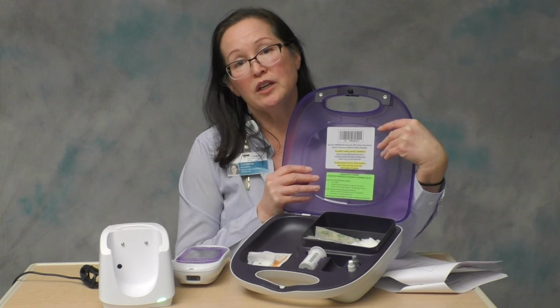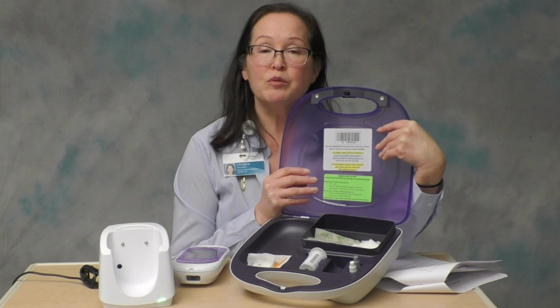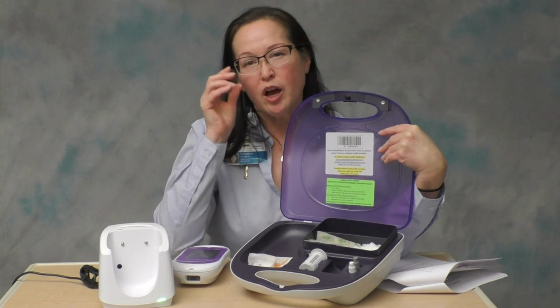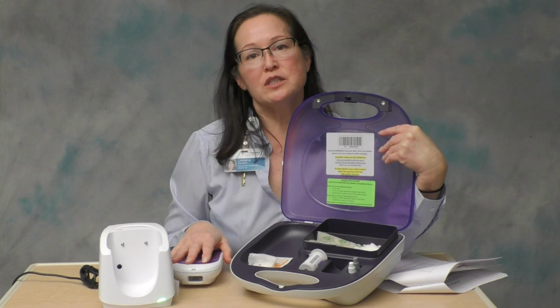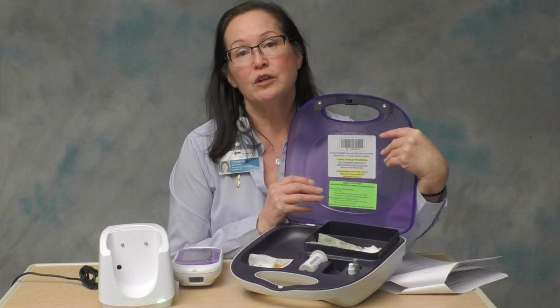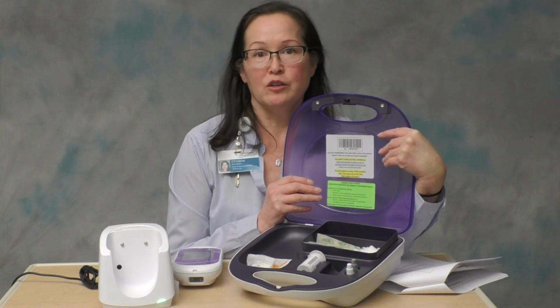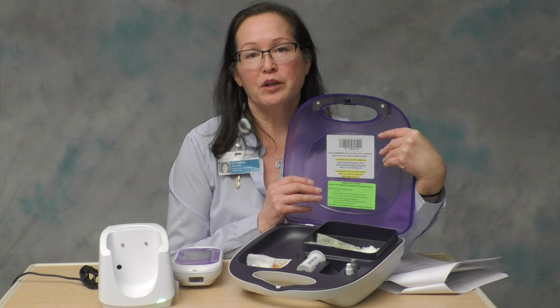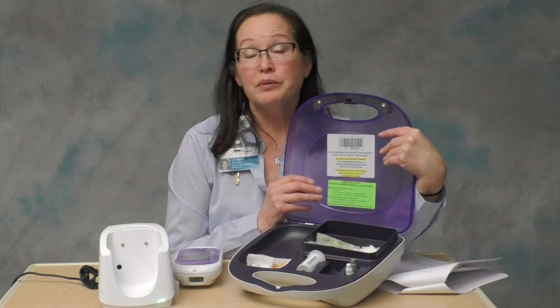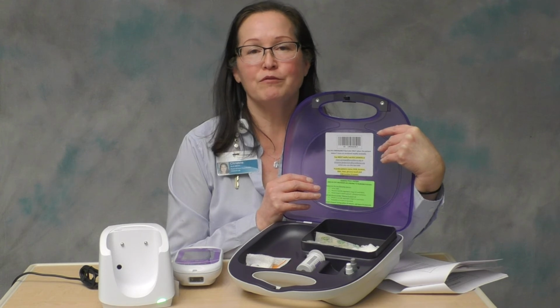So you can use this if the patient has an unscannable armband, or they don't have an armband yet. Also, you can use it on someone who is not a patient. So we frequently, probably 30% of the time, have an emergency glucose test run on a family member or a visitor or a coworker that is feeling lightheaded or they know that they're diabetic and they need to have their blood sugar checked. Please check it. We want to take care of each other regardless of whether or not you're a patient.